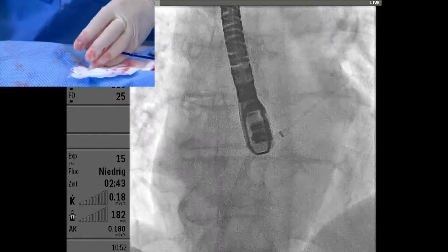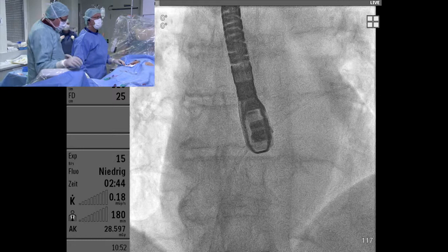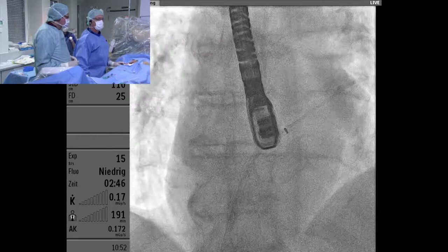The pigtail catheter is being advanced. Adjusting the height of the table. A question is raised about sizing — have we moved away from the 0, 45, 90, 135 degree approach to always using 3D measurement?